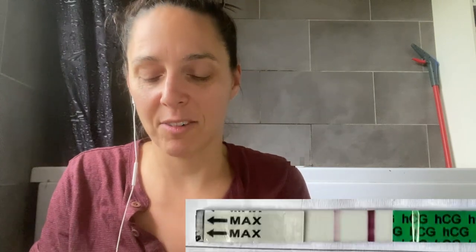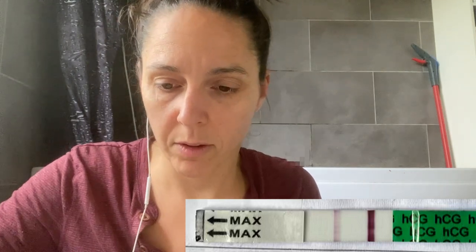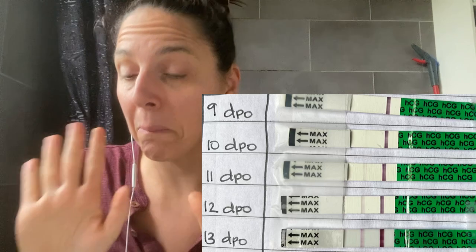So, let's look at the green handle graviditetskollen test now. It kind of looks the same as it was yesterday, to be honest. This does have a higher chemical sensitivity, so maybe it's just going to take a little bit more time to darken up. But we'll have to compare that to the previous tests. It would have been nicer if it was just a little bit darker, to be very honest.